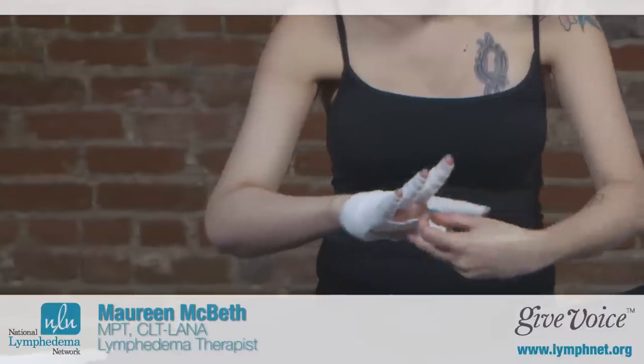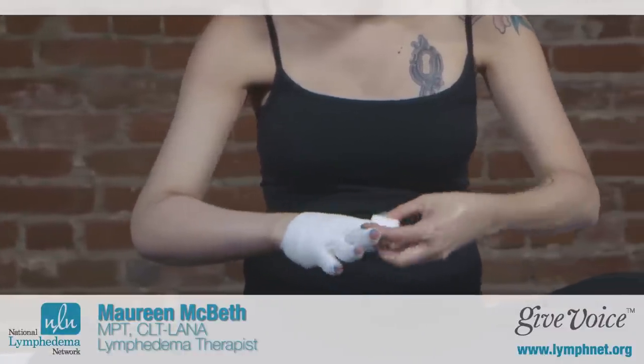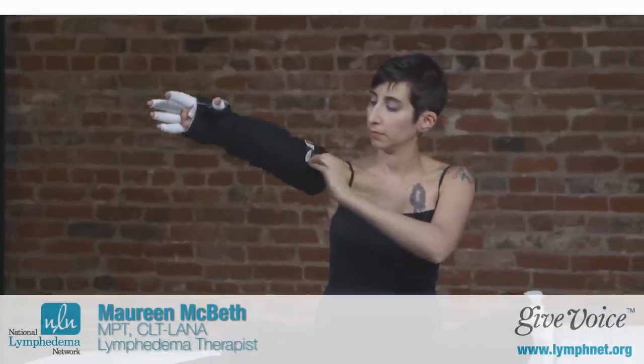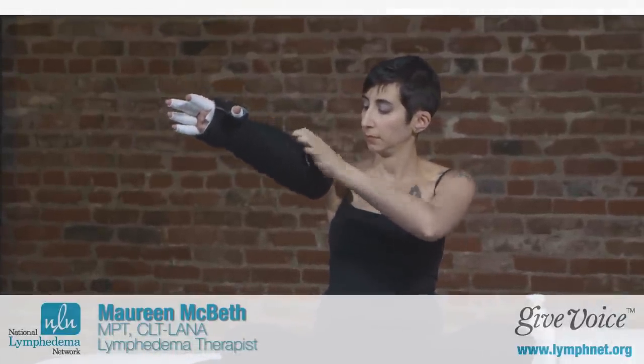Your short stretch bandage is an important part of your self-care. You'll learn techniques of self-bandaging, so you can perform the bandage every night after doing your self-MLD. You'll also learn about bandaging alternatives that make it much simpler and quicker to apply, and hopefully make you more compliant with your treatment. We'll discuss these in other video segments.